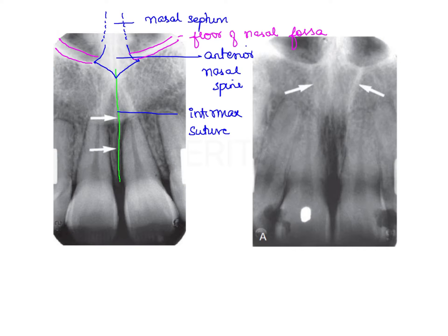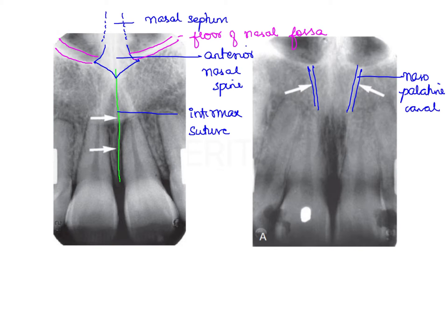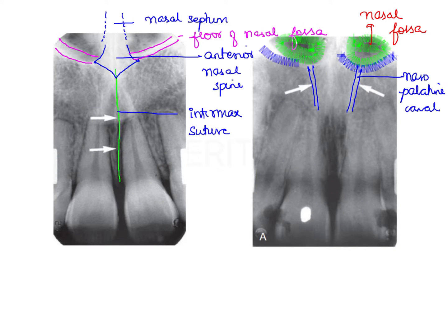Moving on to the second radiograph, we can find a structure marked by white arrows on either side of the midline — this is the nasopalatine canal. Apart from that, in the same radiograph, there is a radiolucency on top, which is the nasal fossa. The lining of the nasal fossa is what we see as the radio-opacity running on either side of the anterior nasal spine.